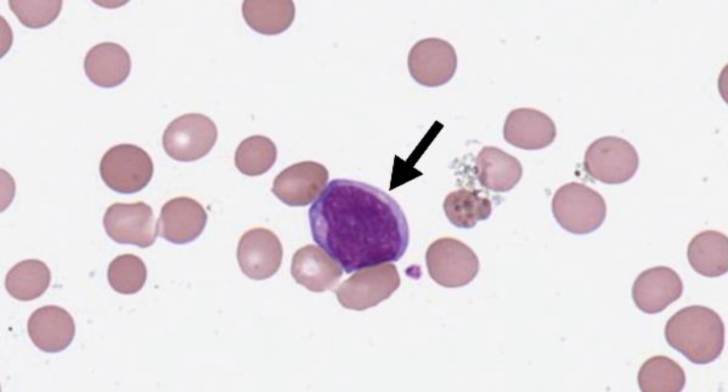Morphologically, lymphoblasts are variable in appearance, sometimes even within a single case. In this patient, the lymphoblasts are small to medium in size, with high nuclear to cytoplasmic ratio, dispersed, not clumped, chromatin, and scant, agranular cytoplasm.